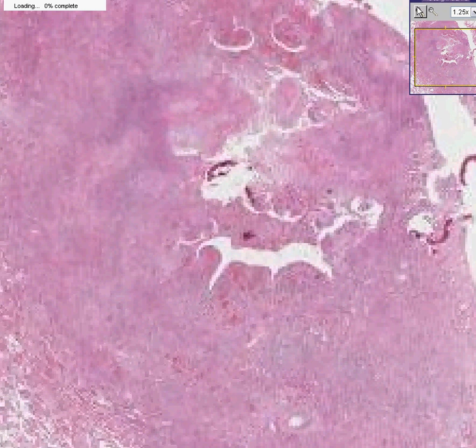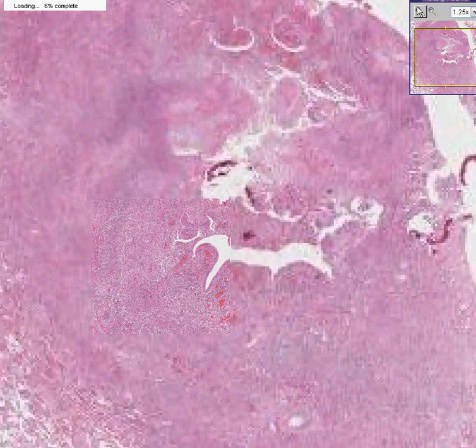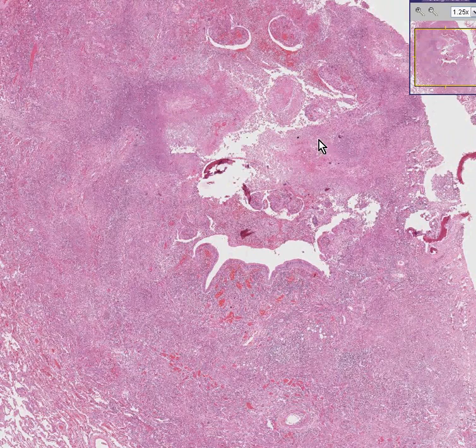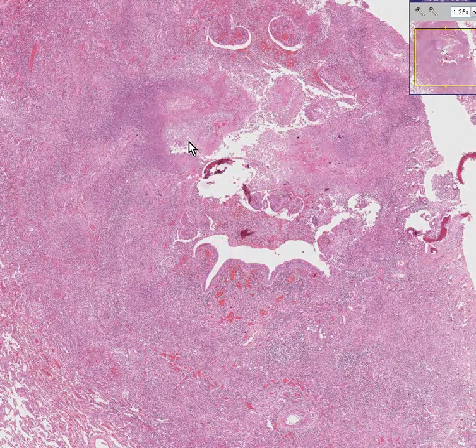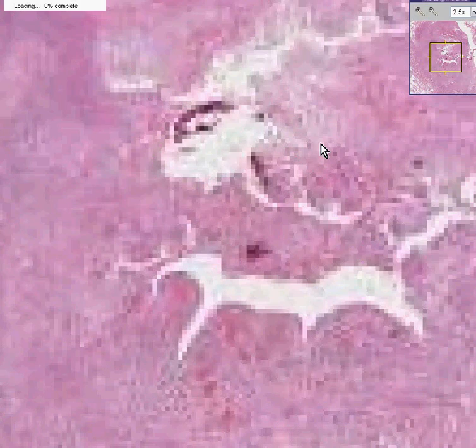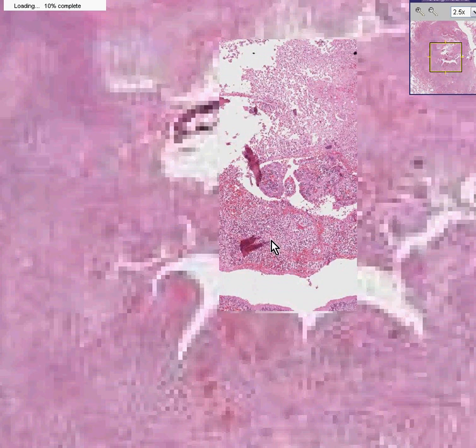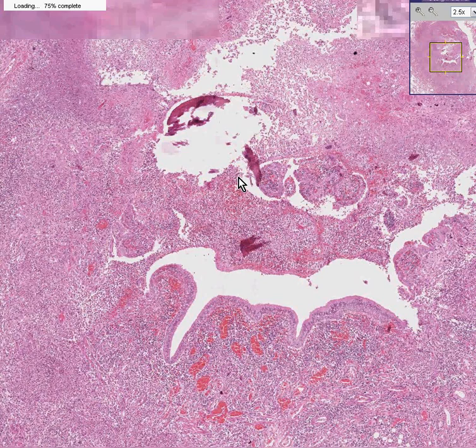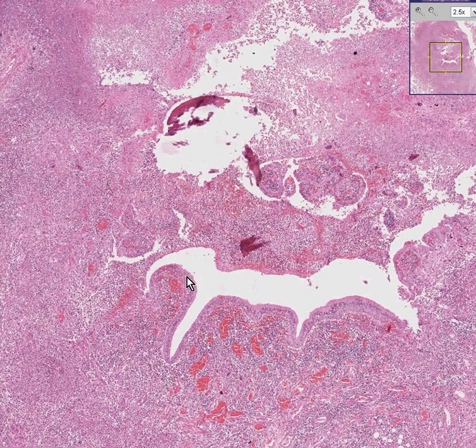Let's look at it a little bit higher. You can see that a large portion of the granuloma is necrotic, even from this power, in that you really cannot make out the outlines of the cells too well. And all you see are remnants of inflammatory cells. In this portion, you could see some remnant of bronchial mucosa.